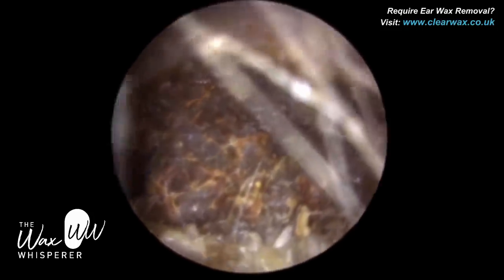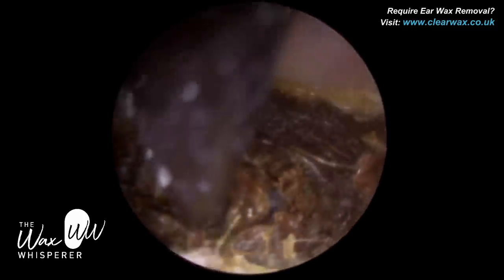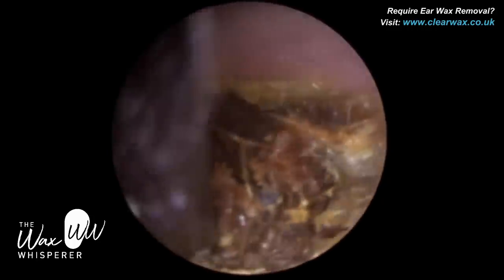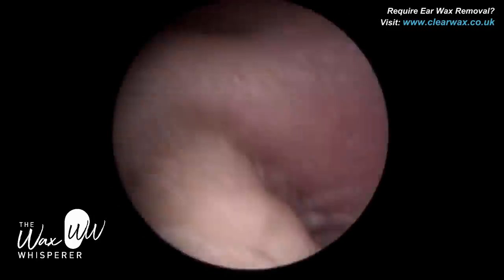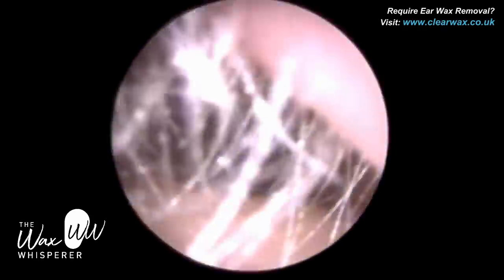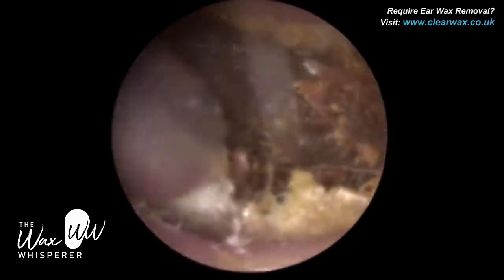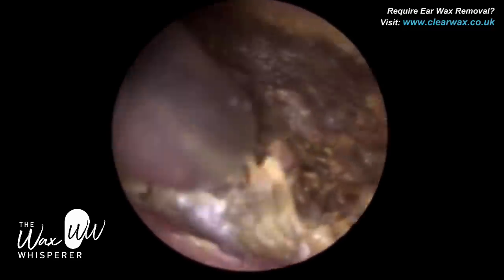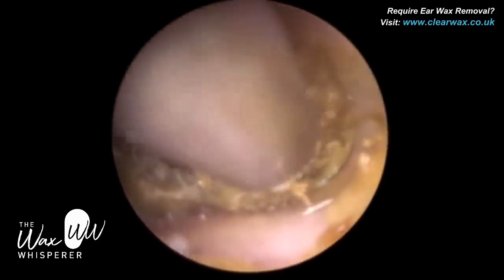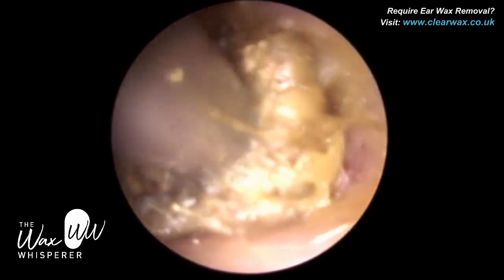What I'm trying to do here is get an earhook into the core of the wax, but it was so rock solid that the earhook couldn't penetrate — it almost glanced off the surface of the wax. So I've gone back again with microsuction, trying to elevate the skin that's coating this plug of wax off the canal wall inferiorly.